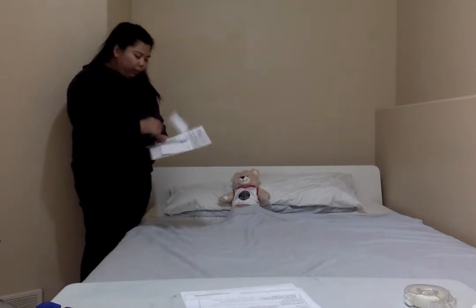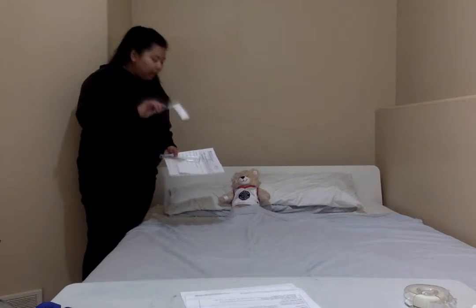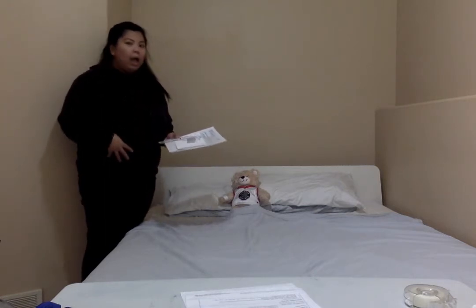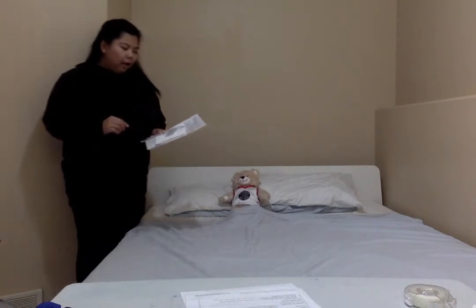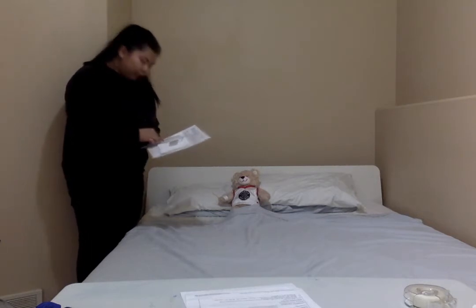So the way that it's going to work is I'm going to inject on your abdomen, and then the medication will be deposited on the fat tissue under your skin. So it might hurt a little bit, but just a little bit. And then we shouldn't see any blood coming out. So are you good with that?